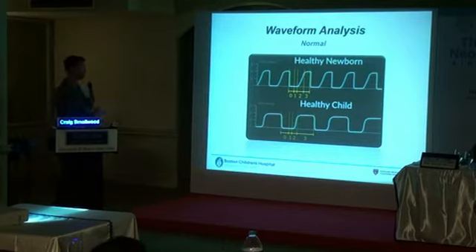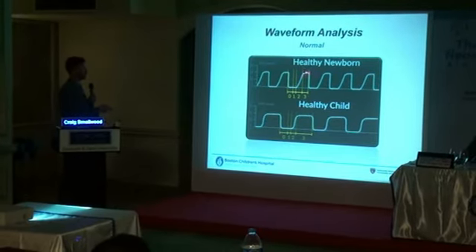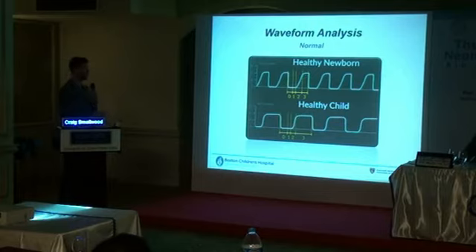And then we can see that there's a really sharp rise during phase 2. That's the mixing phase of the capnogram. That's basically when we transition from the airways dead space down to the alveolar ventilation. And you'll see the highest point here is that moment at which you're eliminating the gas from the deep alveoli, the portion of the breath that's interacting with the capillaries of the pulmonary vasculature, and getting the CO2 out of your patient. So we have inhale, exhale, and getting all the CO2 out.